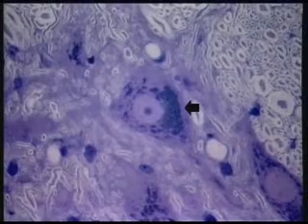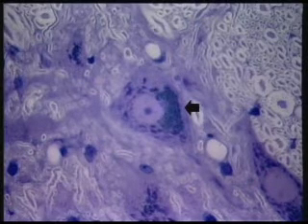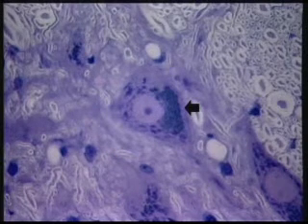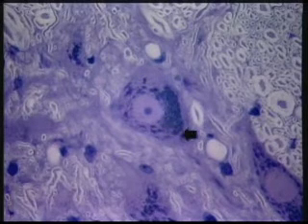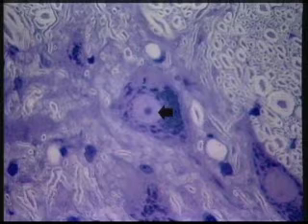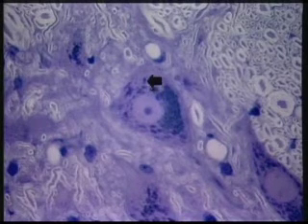Now this is a light microscopic image of a cell that's very different from the pancreatic acinar cell, but still has some of the same components. This is a large motor neuron from the spinal cord, and we're looking at the cell body here. And I'll trace the approximate contours of the cell body with the arrow here. Now, the motor neuron has a large centrally located nucleus here, and it's mostly clear. It's mostly euchromatic. There's a dense nucleolus in the middle, and then you can see some sort of purplish patches.